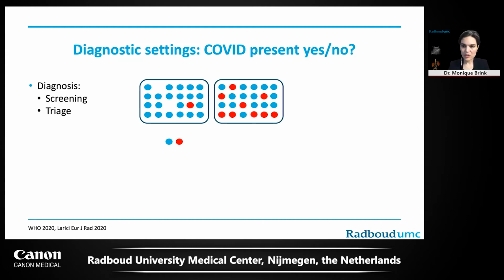You have a triage situation, which means that you have a lot of patients with clinical suspicion of COVID-19, but you did not perform other tests yet. So CT is the first diagnostic tool you use in a diagnosis. You don't have PCR yet or otherwise, and you would like to roughly discriminate patients with a very high likelihood of disease from patients who don't have COVID-19.